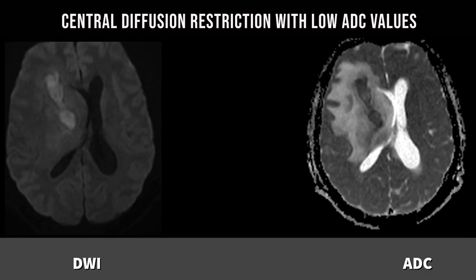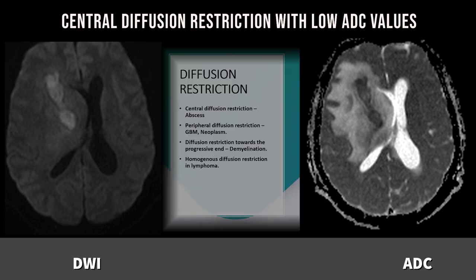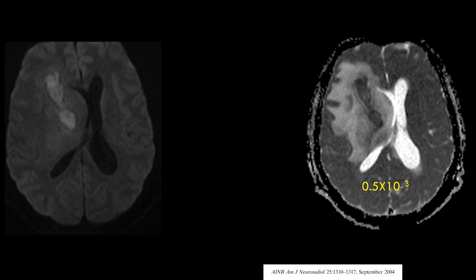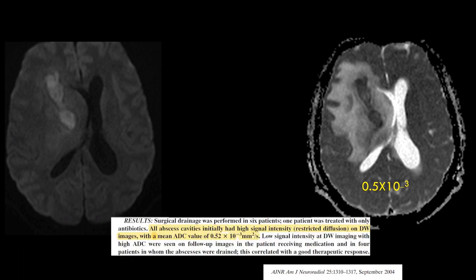The role of diffusion weighted imaging is very important here. What you can see is restricted diffusion foci. Though there is heterogeneity, there is significant restriction of diffusion. There is intermediate signal and the wall is also showing hypointensity. The ADC value is approximately 0.5 × 10⁻³ mm²/s. Very few diseases go below 0.7 or 0.6, and one of them is abscess formation. Restriction of diffusion in the central part of the abscess comes as close values as 0.5 to 0.6 × 10⁻³ mm²/s.